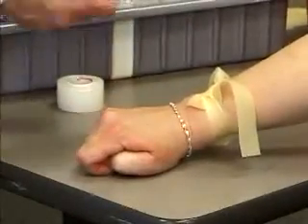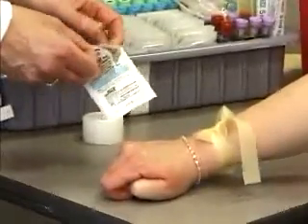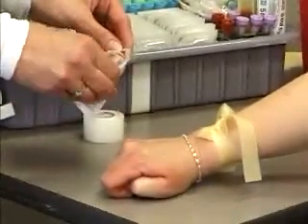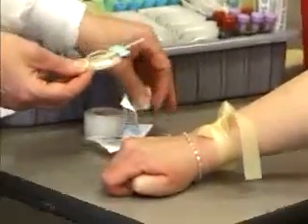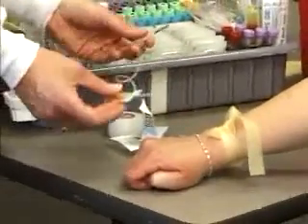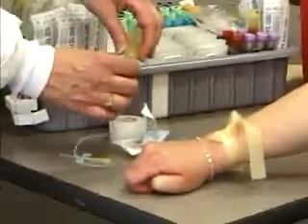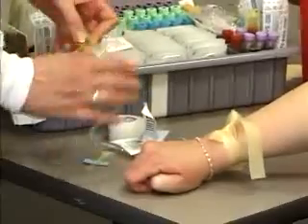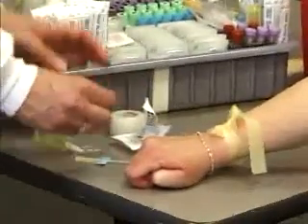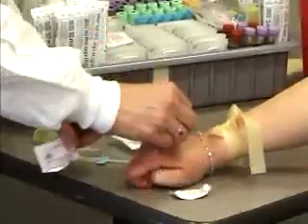For this procedure we're going to use a butterfly — you would always want to use the butterfly on the back of the hand, never a vacutainer needle. It assembles very similar to the vacutainer needle; you put your holder on the end, which allows you to use the evacuated tubes.